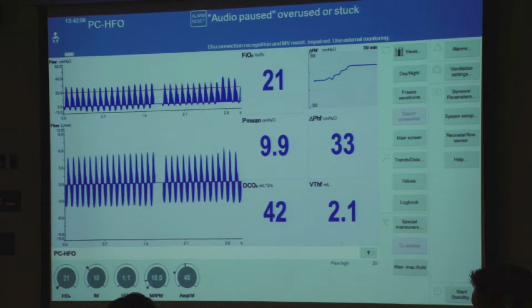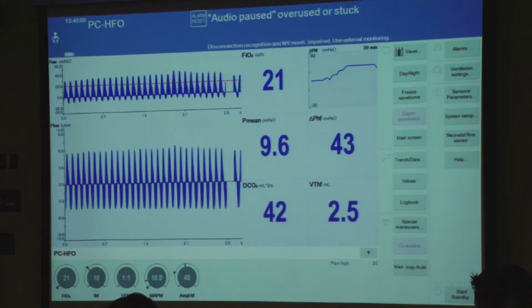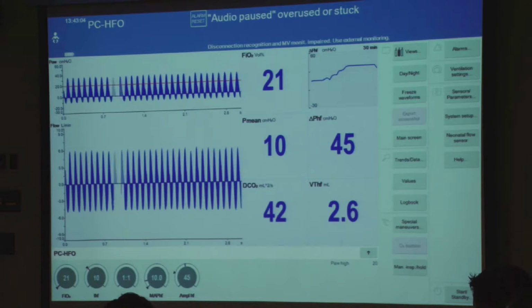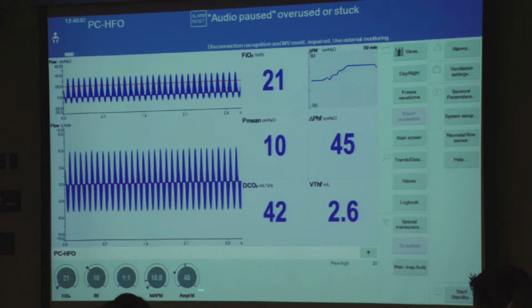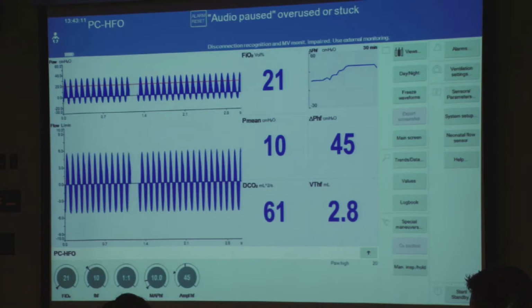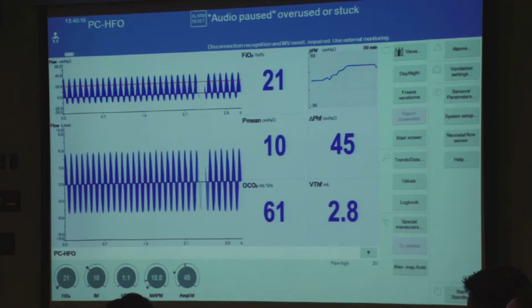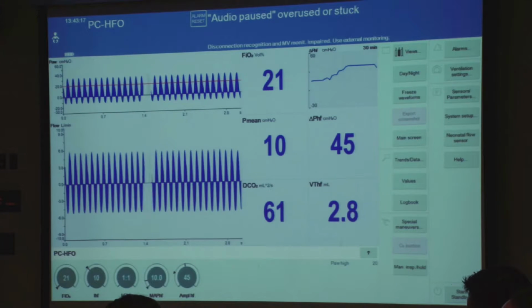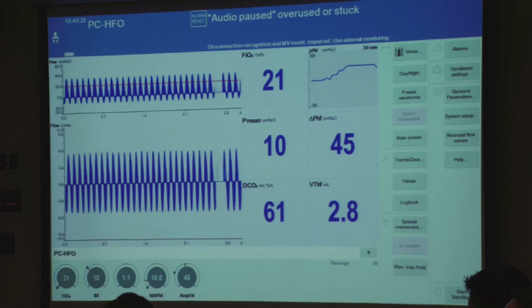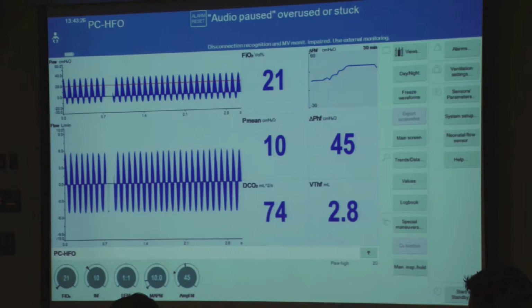Before, we were maxed out at 37, and now we boost the ventilator and go to 45, exactly what we've dialed. That's why we ventilate term babies with 1:1, because we have more power. And you hear the ventilator working differently. It's actually performing better. You don't have trouble with air trapping?